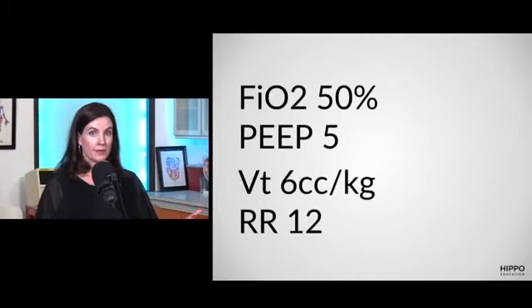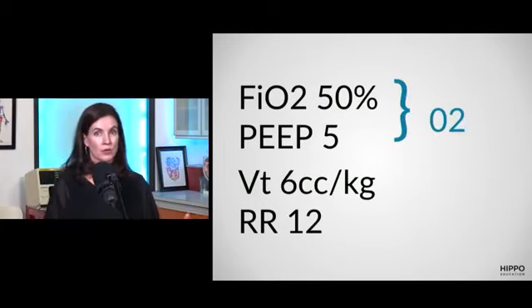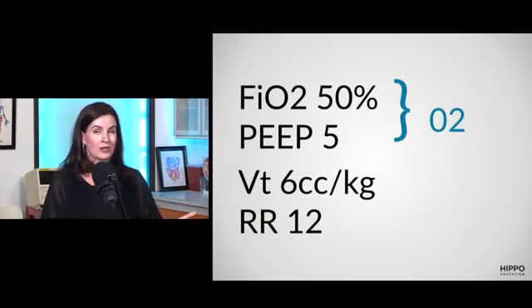Cool. All right. So to summarize that, when you have a hypoxia problem, your FiO2 and your PEEP are your components of your vent that you can titrate to help either turn your oxygenation up or down to the saturation that you want. I'm generally shooting for a SAT of 95 to 97. I don't go to 100 with very many people because I can make them hyperoxic, but anywhere in the high 90s I think is reasonable.